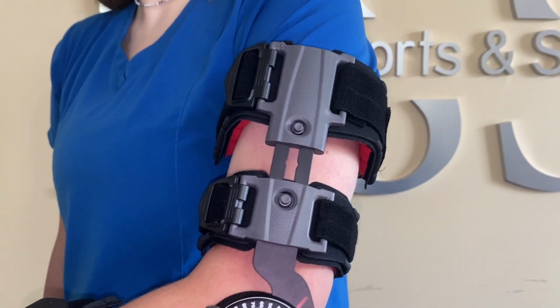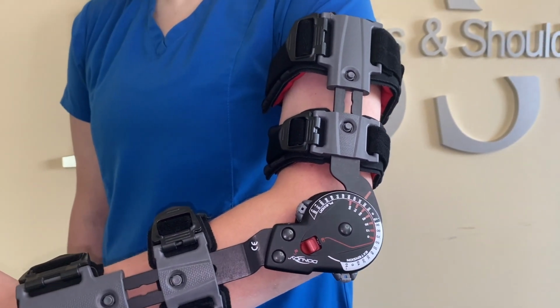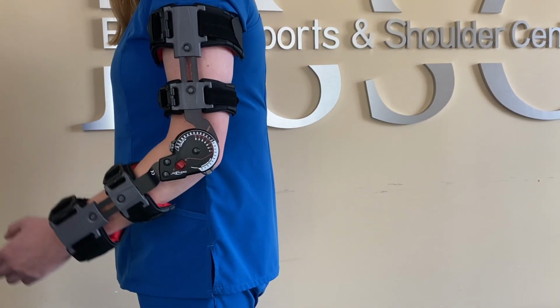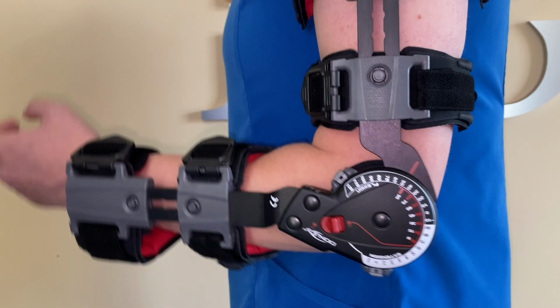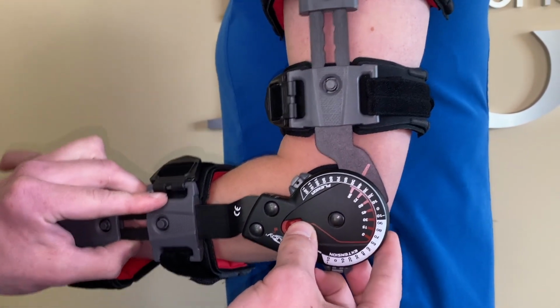The center or hinge portion of the brace will be aligned with your elbow. On the hinge portion of the brace, you will see that the brace can go into a full 120 degrees of flexion and negative 10 degrees of extension, which allows for full range of motion. This will be appropriately locked by your provider to ensure appropriate progression of range of motion as well as overall protection of your elbow.